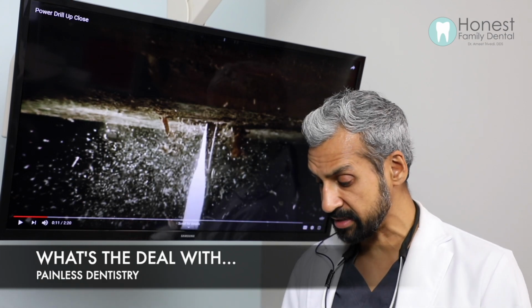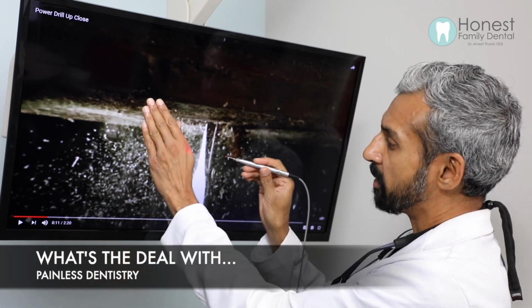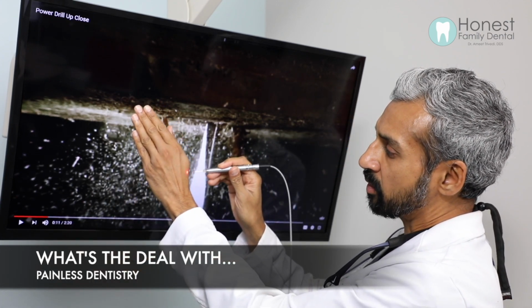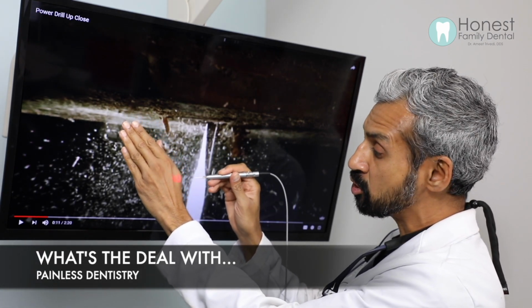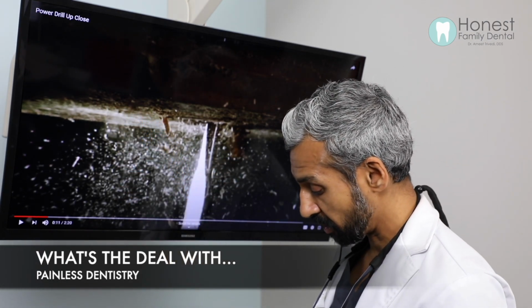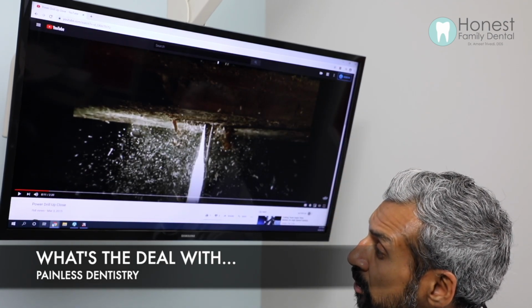This is kind of what the laser looks like. Right over here, the red light, I point it in my hand, and that's exactly what I do. I'll just wave it over the tooth. I actually don't touch the tooth with it because it's just utilizing light energy, okay? So this is basically what the procedure looks like.